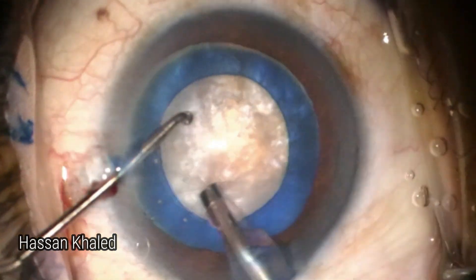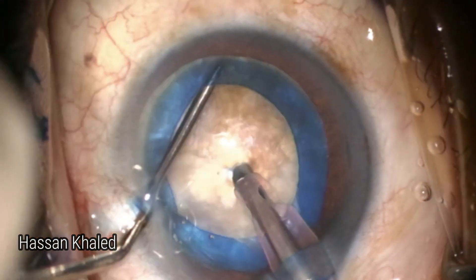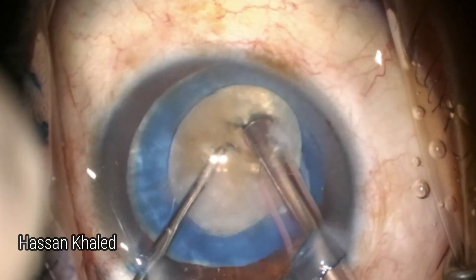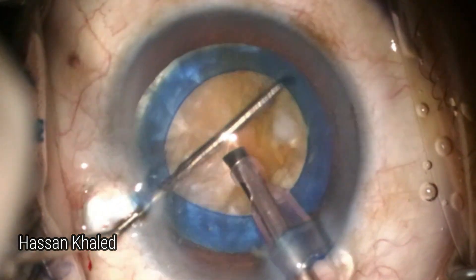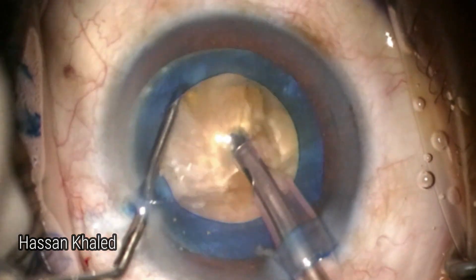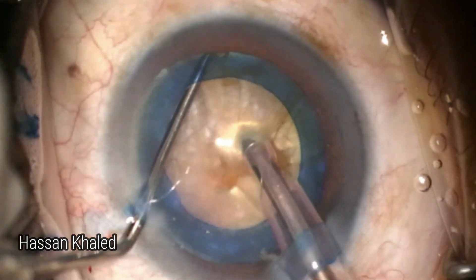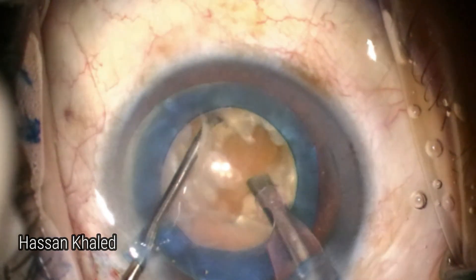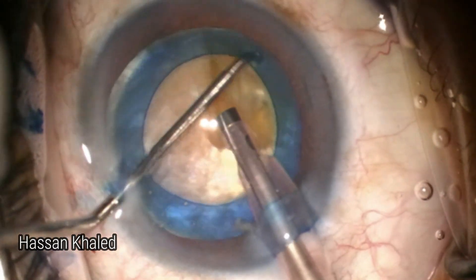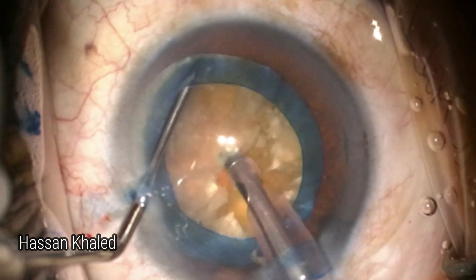Here is the emulsification of this cataract. Look at that density — it's a brown dense nucleus. You can see the elasticity and the strength of the rim of the anterior capsulorrhexis, which is very strong and elastic, helping the surgeon in introducing instruments. You can see the chopper going while chopping this dense nucleus, using the horizontal chop technique.